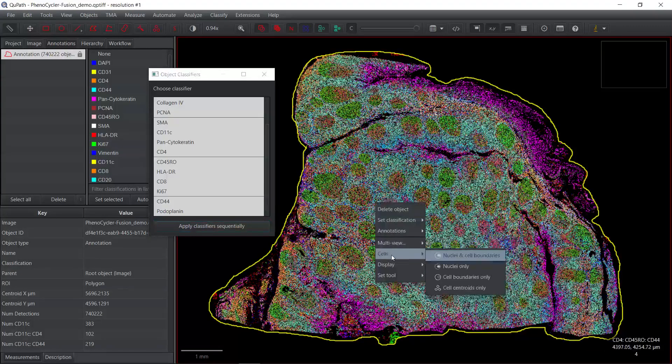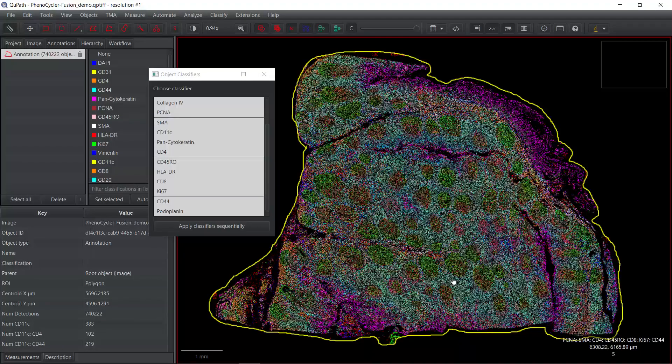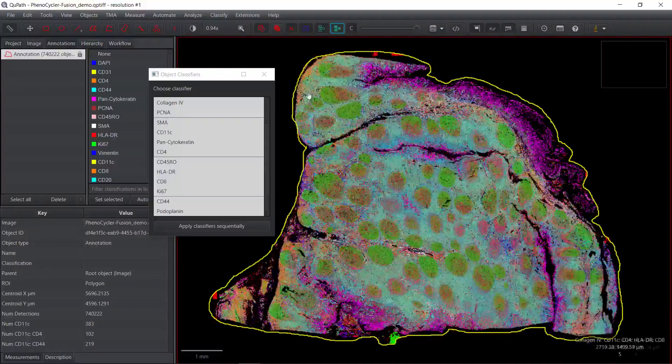You can see we should have the positive staining cells for each antibody. Now we can change the view for the cells. We can just see the cell boundaries only, and also we can fill the cells. Now we can zoom in. You can see individual cells. The color will represent the antibody staining. Of course, cells may express different proteins, so those cells have a combination of different colors. When we apply the classifier sequentially, QPath will automatically calculate the intensity for each antibody stain in the cells. Then we can see the measurement. We can show detected object measurements. If you press it, we can download the table. Because we have more than 740,000 cells here, it takes time to download the table.